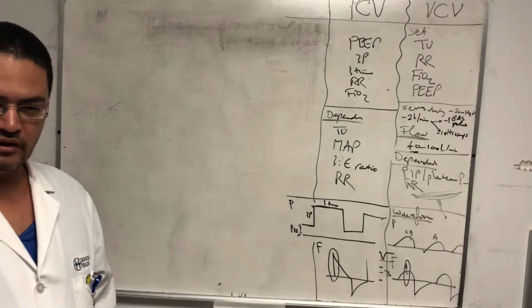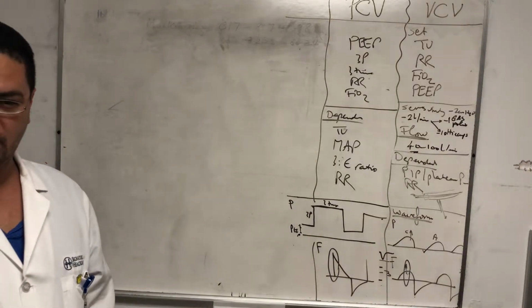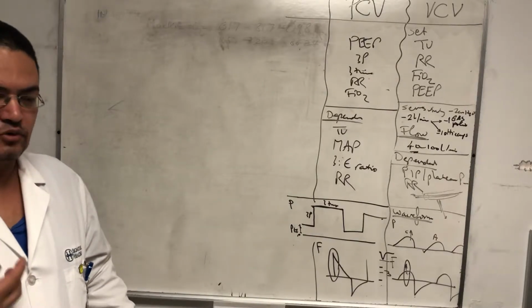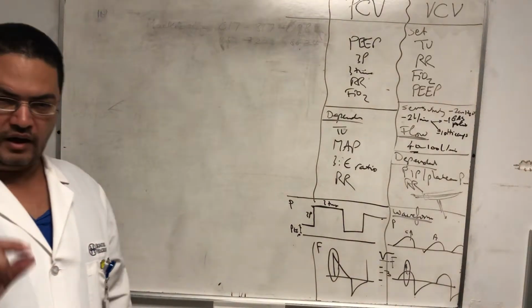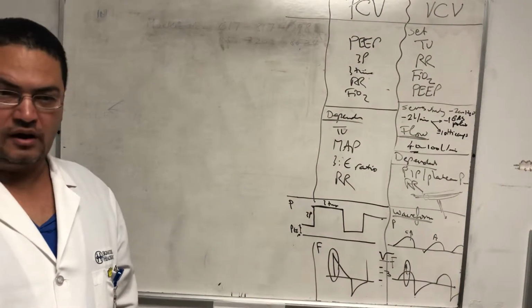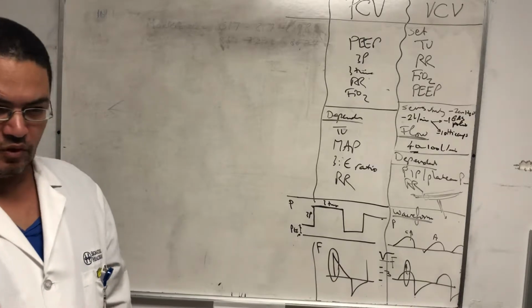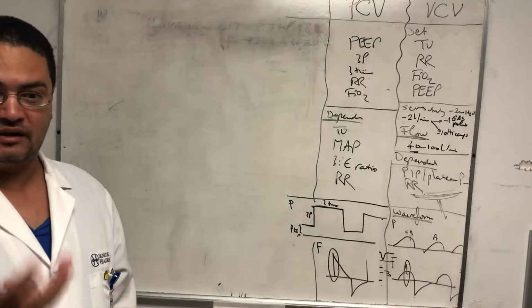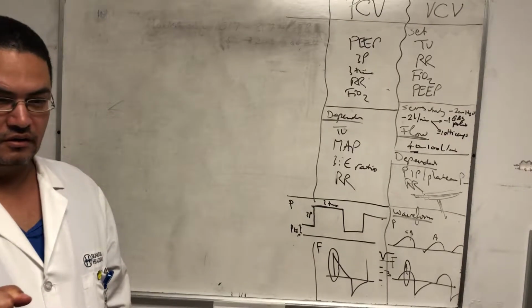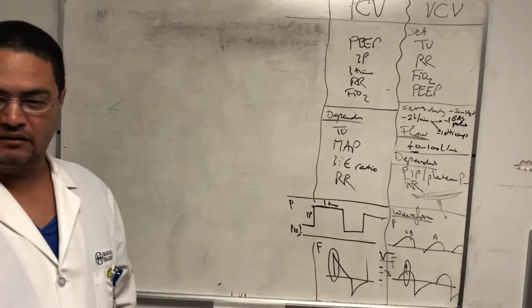So that's why when we breathe 21% oxygen and 79% nitrogen, that's actually good. Why? Because oxygen at some point is going to get absorbed, especially in the lower parts of the lung where the alveoli are not completely inflated. It can potentially absorb all the oxygen into the blood, because those are also the most perfused areas. And if you absorb all the oxygen in the blood, if you're on 100% oxygen, the whole alveolus can collapse completely, right? And then you come with the next breath and open it again. That's called atelectrauma, and that releases cytokines.